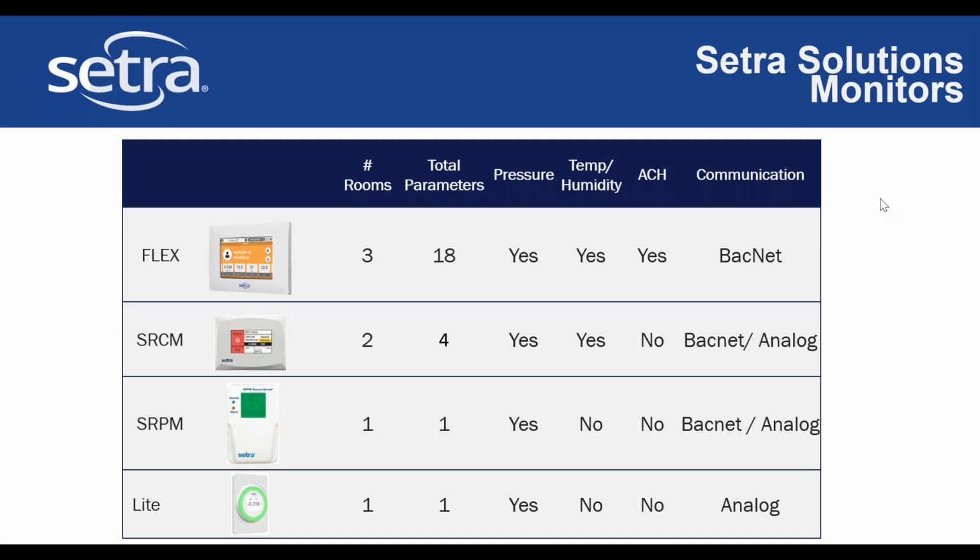Another question by Haroon is, can you include temperature and humidity in the same pressure monitor? You can do temperature and humidity on the Flex. We can put temperature, humidity, and pressure all on the Flex unit. You do have to have an external temperature and humidity sensor for that. We don't build that into a Flex monitor at this time. SRCM does also have the ability to display that as well.